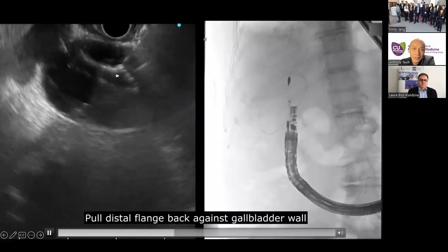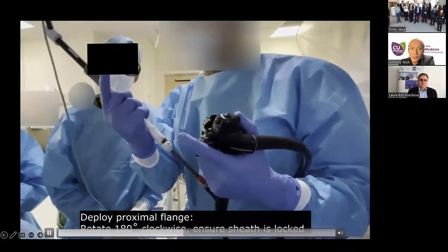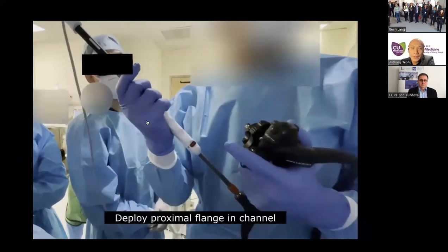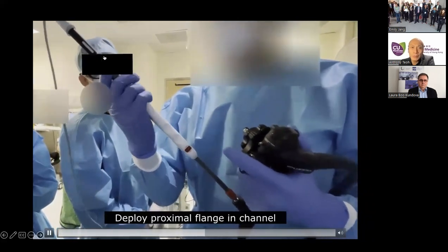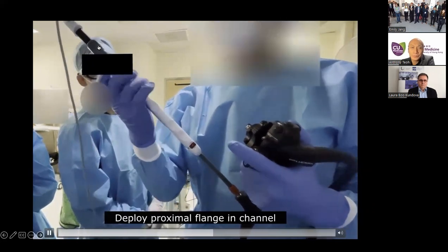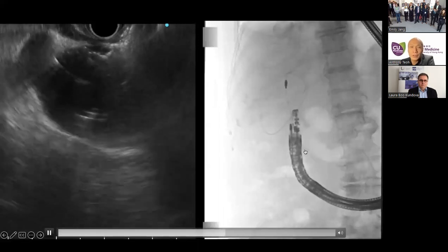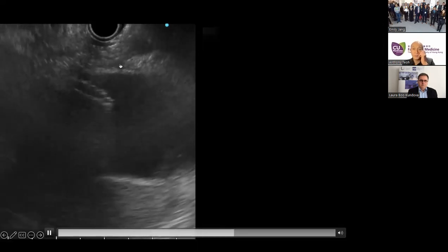When the stent is opened, we approximate the lumen by pulling back the stent. And then we rotate 180 degrees and open the remaining part of the stent inside the channel of the echoendoscope. And then we push out the stent as per usual.